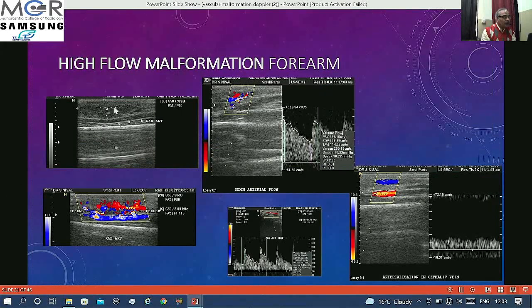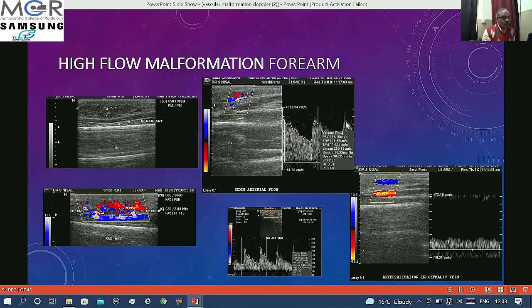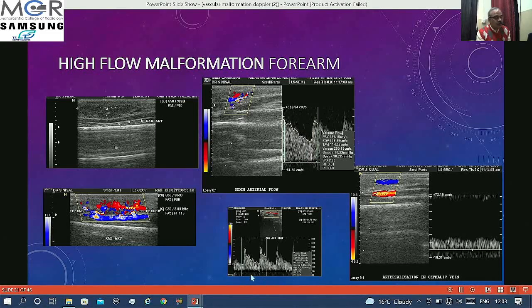Another example in the forearm: a small lesion where the plastic surgeon could feel pulsatility and advised ultrasound. It was sitting above the radial artery. On Doppler, it is all filled with color with aliasing at multiple places, showing very high systolic and diastolic components. The radial artery feeding this lesion also shows continuous systolic and diastolic flow with loss of triphasicity and increased flow volume. The cephalic vein shows arterialization of flow — all characteristic features of AV communication.